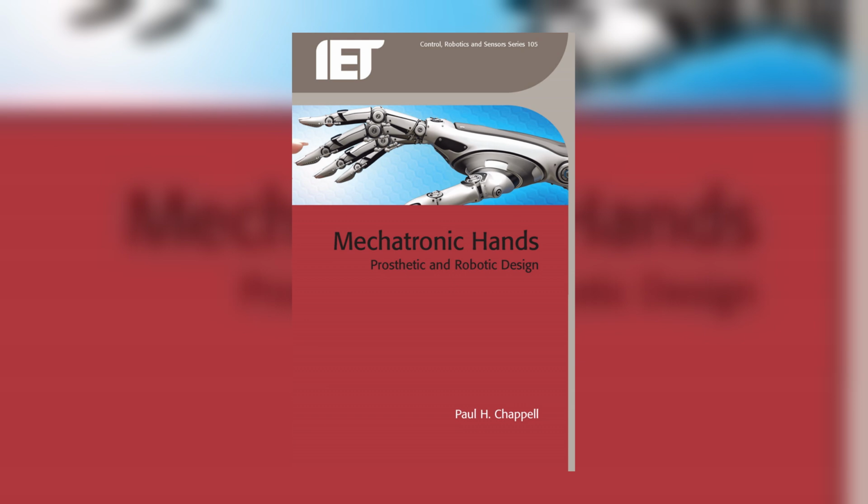Chapter 3 is where the mechanism earns feedback, becoming a system that knows the object it holds. The compression sits in one line. Every sensor is a physical variable: force, joint angle, slip, temperature, modulating one of exactly 3 passive electrical quantities: resistance, capacitance, or inductance.